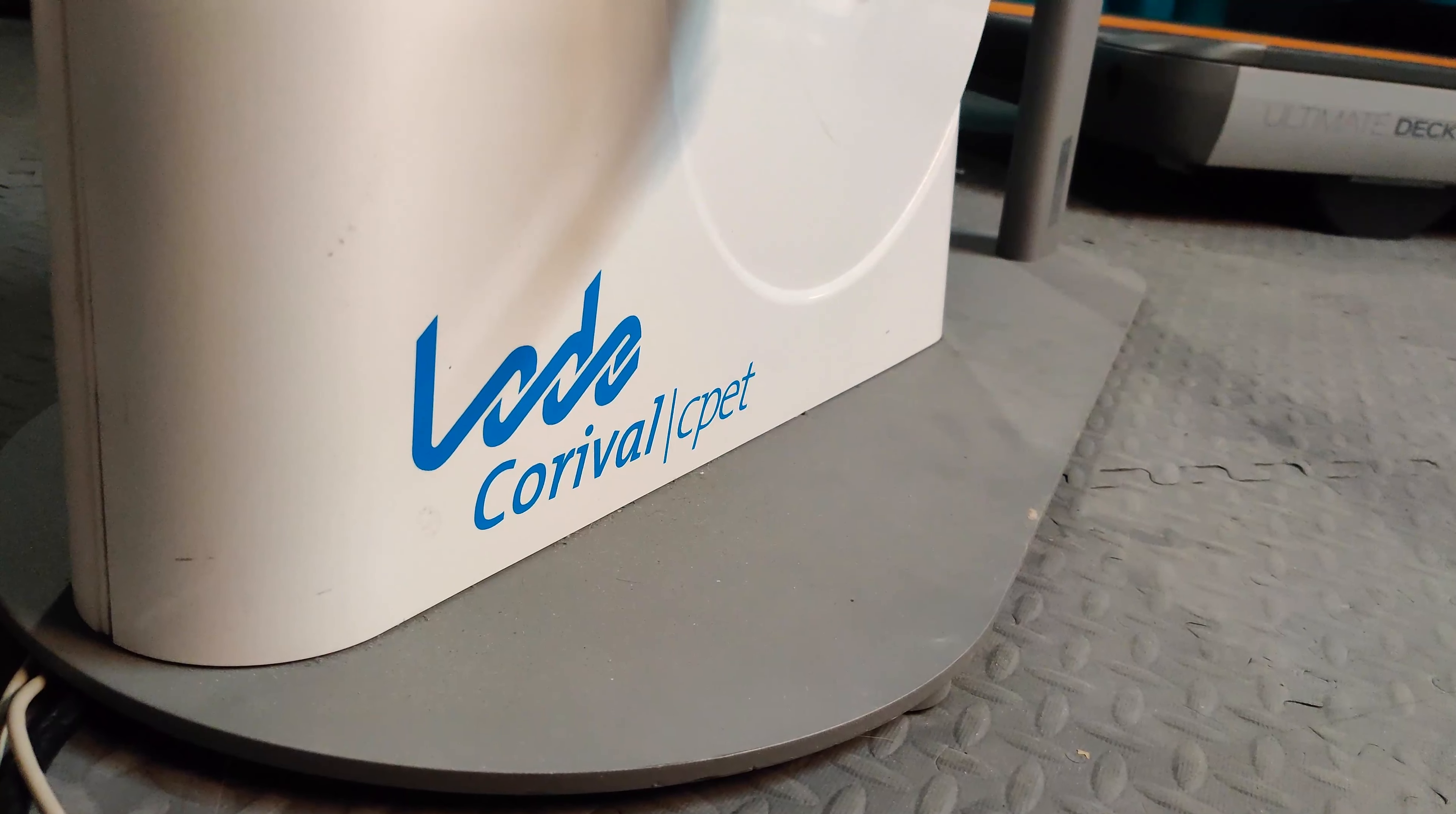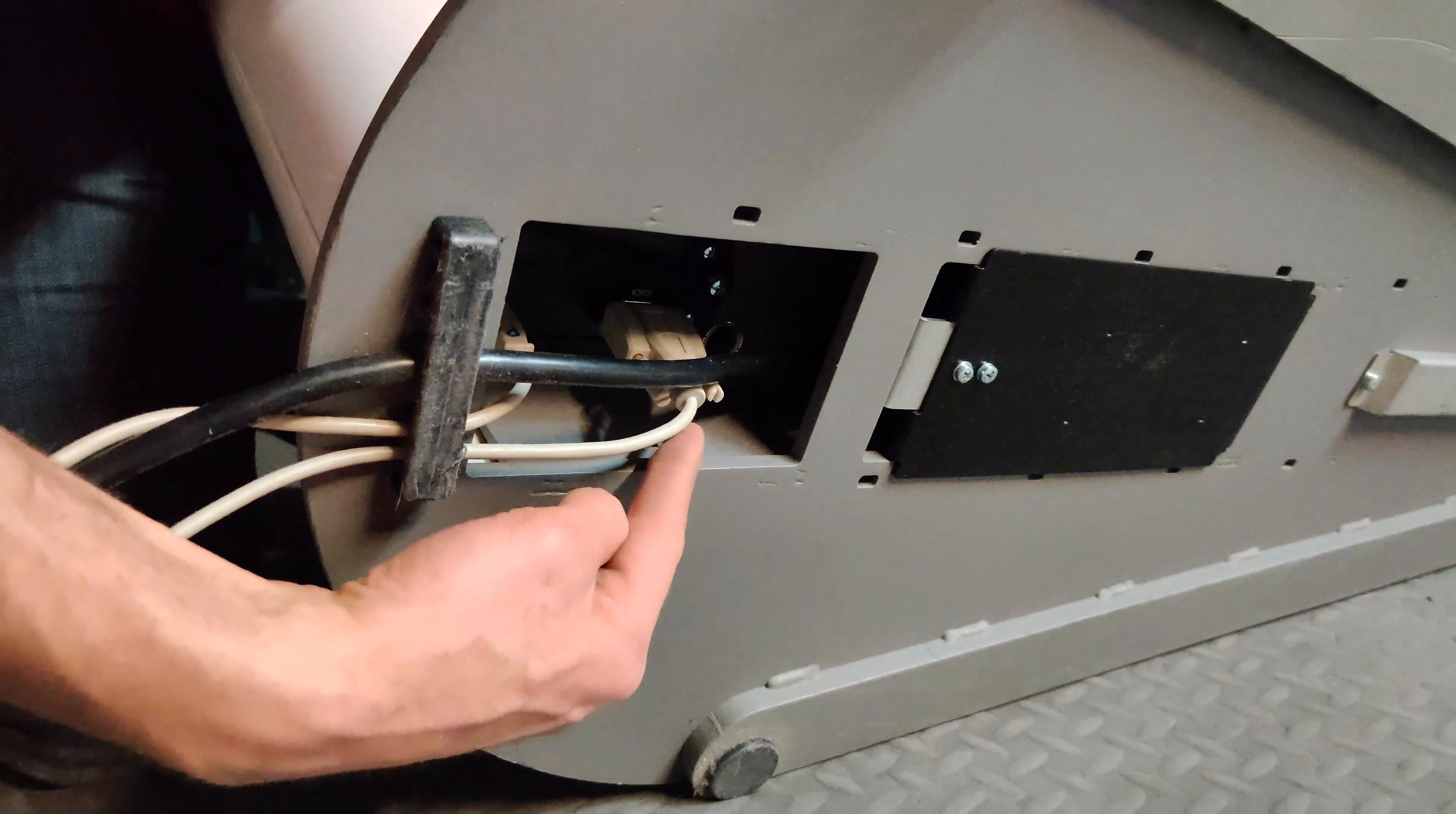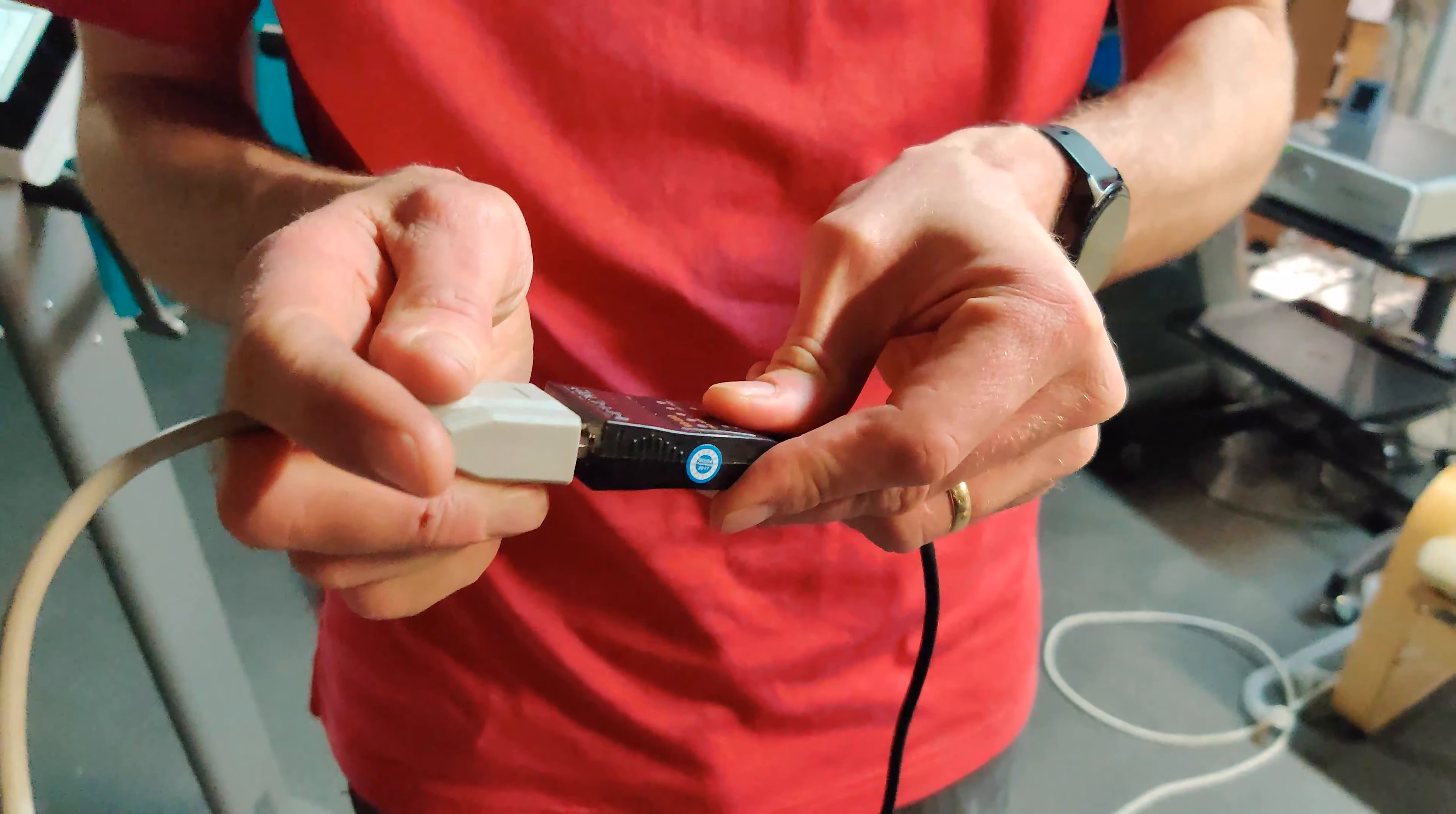Connecting your Lode ergometer to your CardioCoach software requires a hardwire connection with either a USB or serial cable. Note that using a serial cable may require a serial adapter.